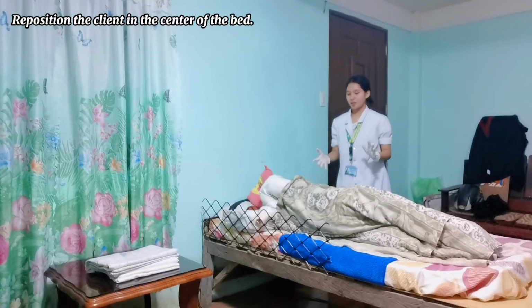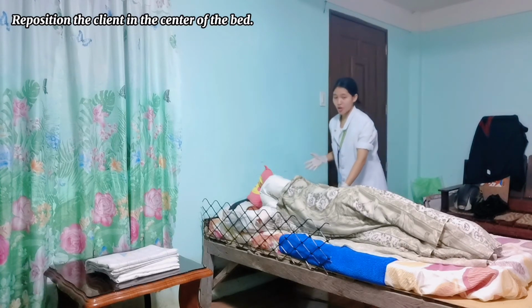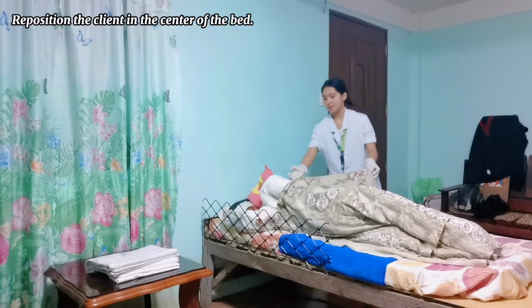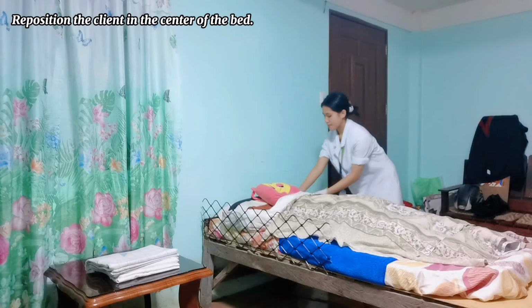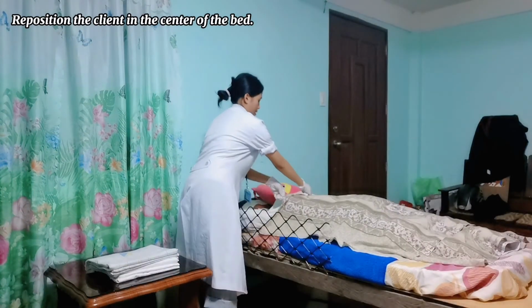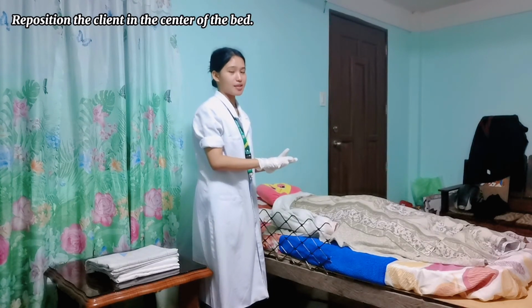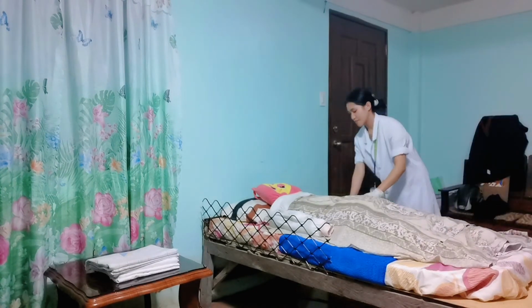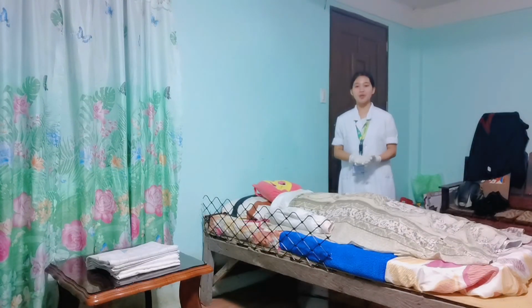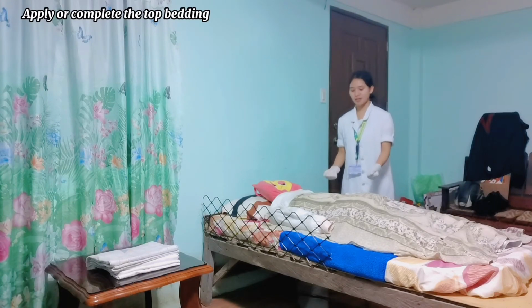After that, the next thing that we will be doing is to assist the patient to move to the center of the bed, onto his back. This will provide the client comfort. And then we will place the top sheet over the patient.